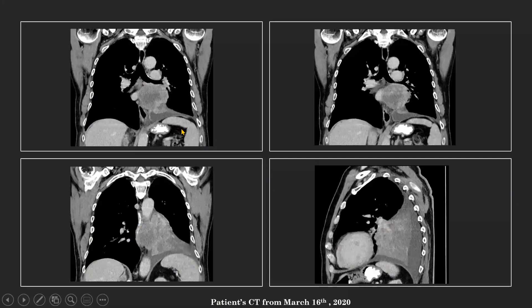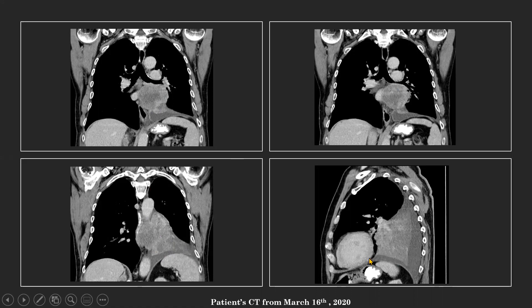On coronal images, the secondary bronchi are clearly evident on the right, but on the left a branch is missing due to the mass causing obstruction leading to atelectasis. The triangular-shaped structure represents the atelectatic left lung lobe. Together with the pleural effusion and the soft tissue mass — the esophageal cancer — these are the key coronal findings.